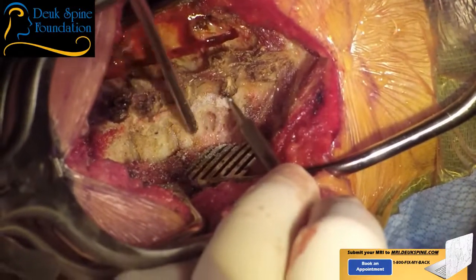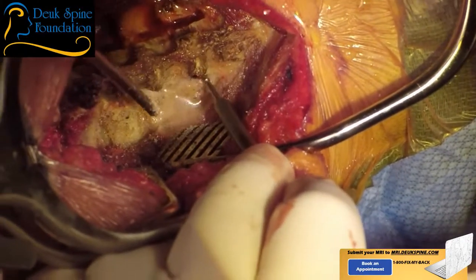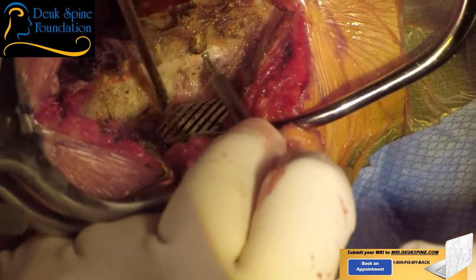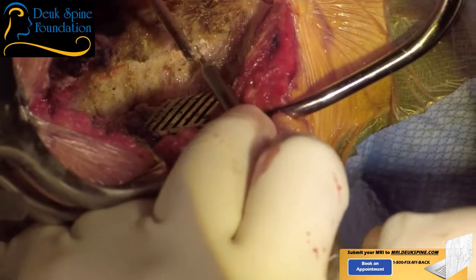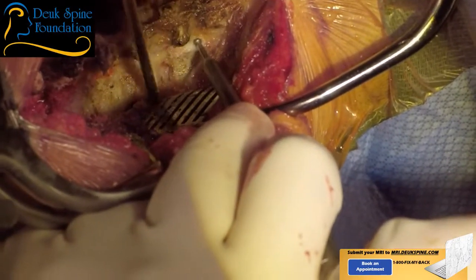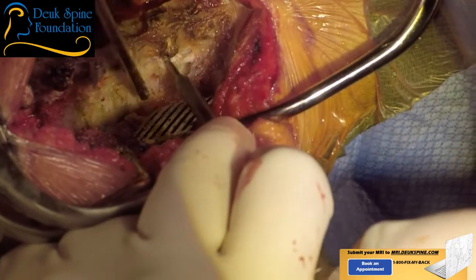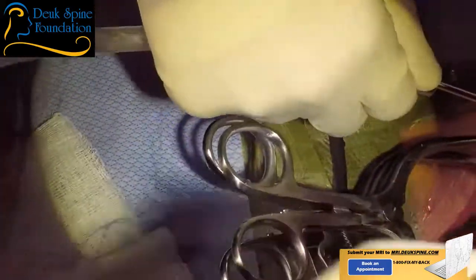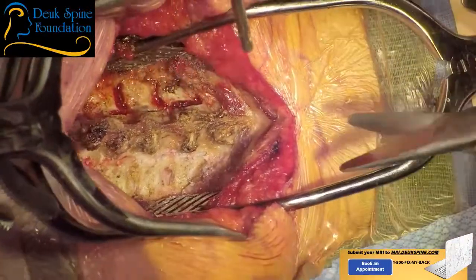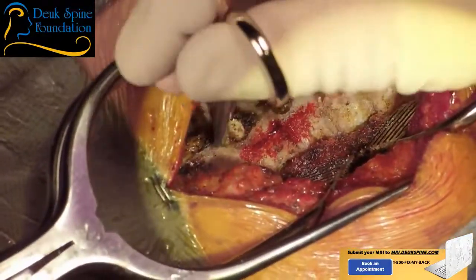Okay, last one. Careful. This will be C3. You can see the diploic bone. You see how there's a lot of poking. Careful. All right, that's loose. So now I've basically osteotomized along the spinolaminar line from C3 to C7. Now you want to cut the supra- and interspinous ligaments that are left with a scissor, a heavy scissor.